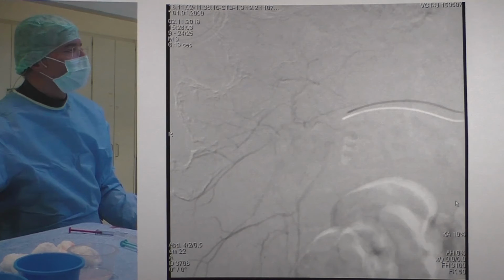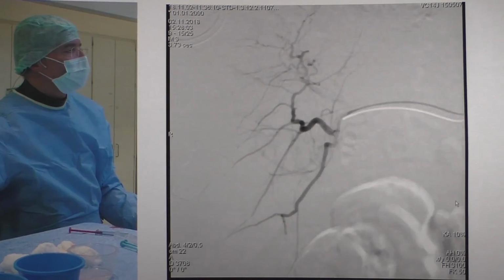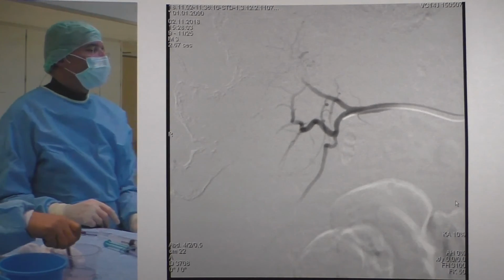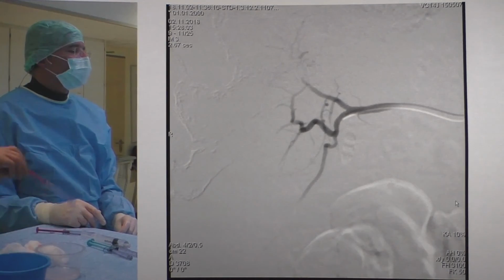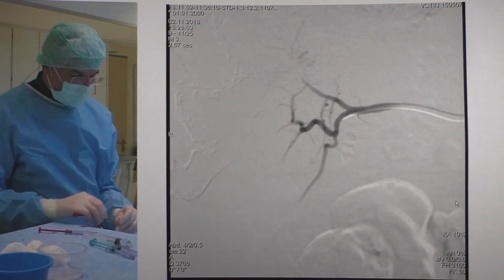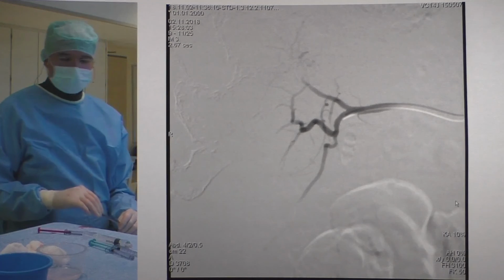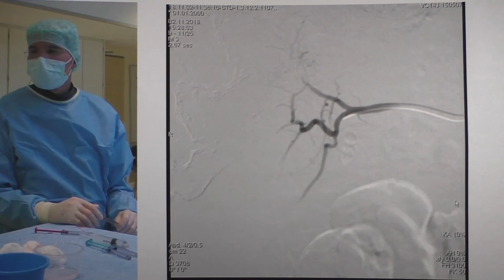But that's typical for a live case, isn't it? Then all of a sudden here you see the cranial vessel, a corkscrew style vessel, and from here you can then visualize the tumor. So apparently that's not going to get easy.